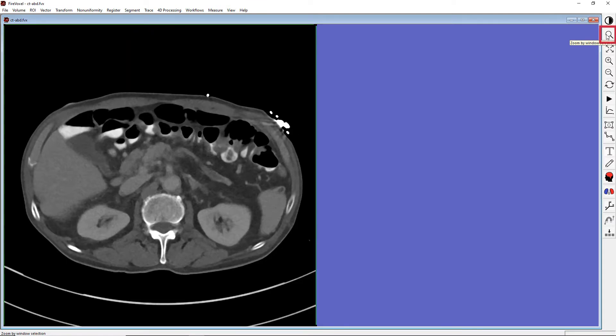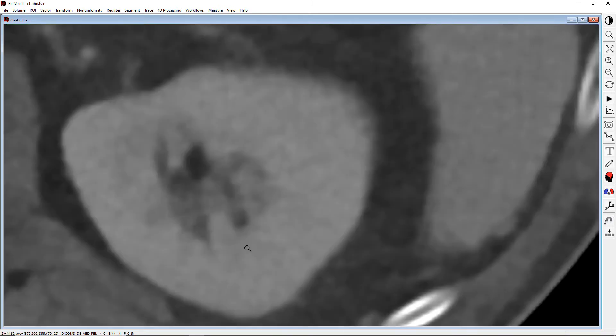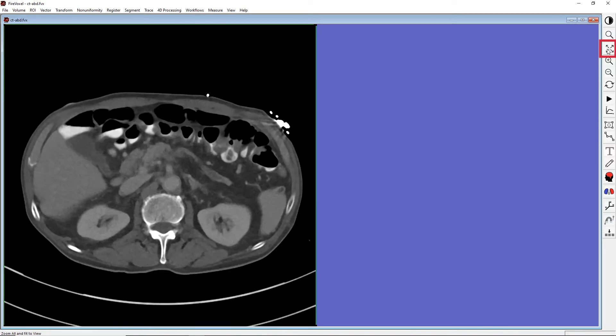Activate this tool by clicking the toolbar icon with a magnifying glass. Now, let's click on the image and drag the mouse over the part that we want to enlarge and then release the mouse. To unzoom or restore the original view, use Zoom All by clicking this icon with four arrows.